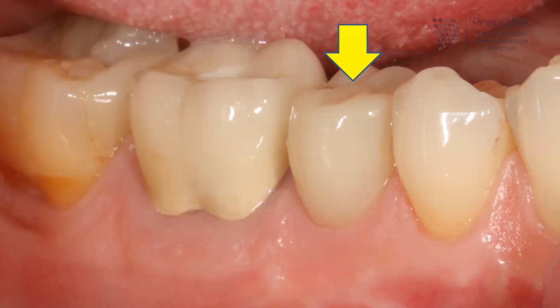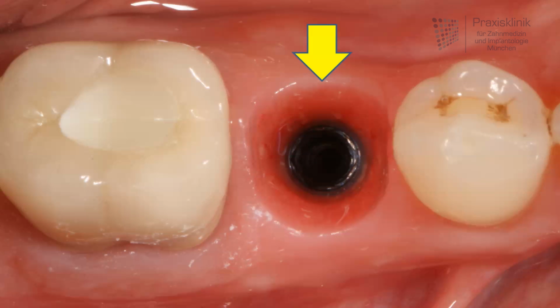You can see here the temporary indicated by the yellow arrow after 4-month wearing. And you can see the soft tissue here absolutely perfect. You can nearly not distinguish which one is a tooth and which one is an implant. So this is the situation before we take the impression. You can see the implant healed perfectly into the bone, and the soft tissue around is just complete without any inflammation and looks nice and healthy.